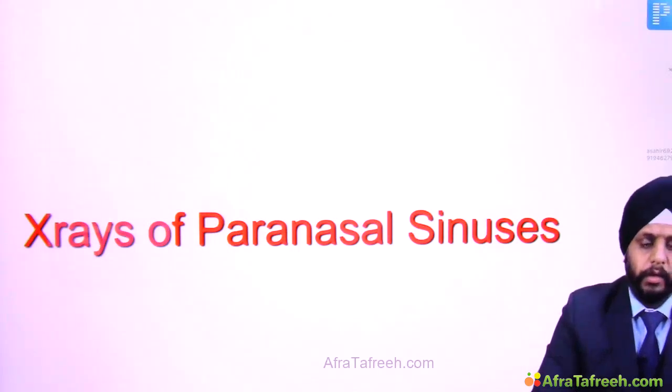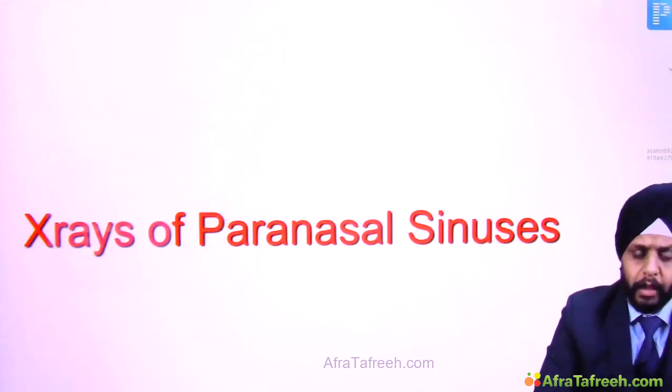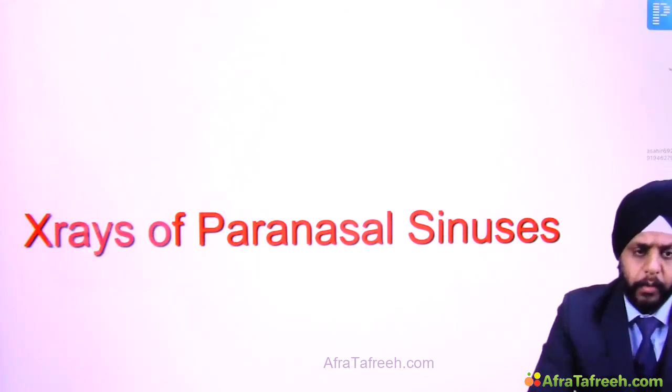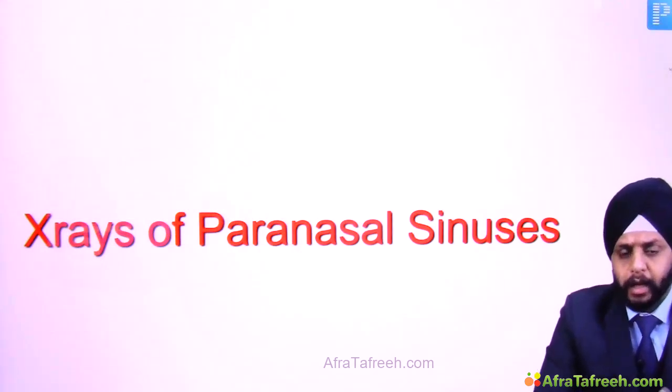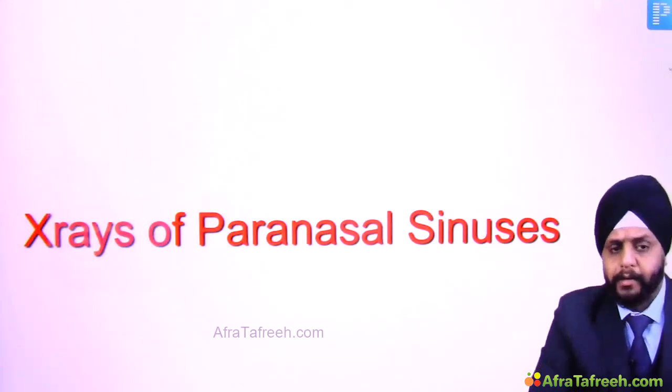It is being asked regularly in the different MCQ exams. We'll see a lot of questions have been asked in the last few years itself. And it will help you understand the anatomy and the further radiology, the CT scan of the paranasal sinuses. So let us start with the X-rays of the paranasal sinuses.